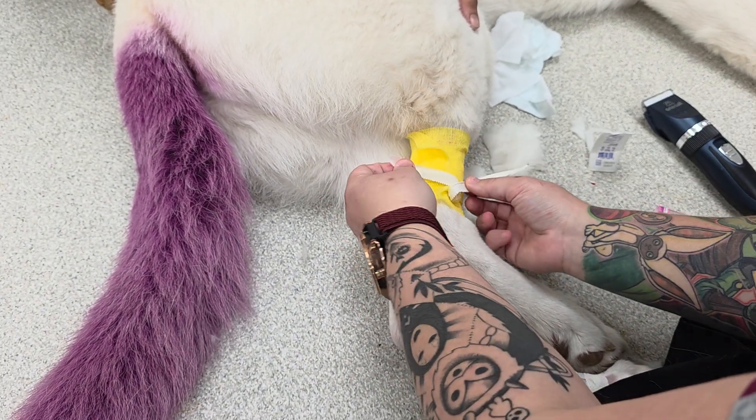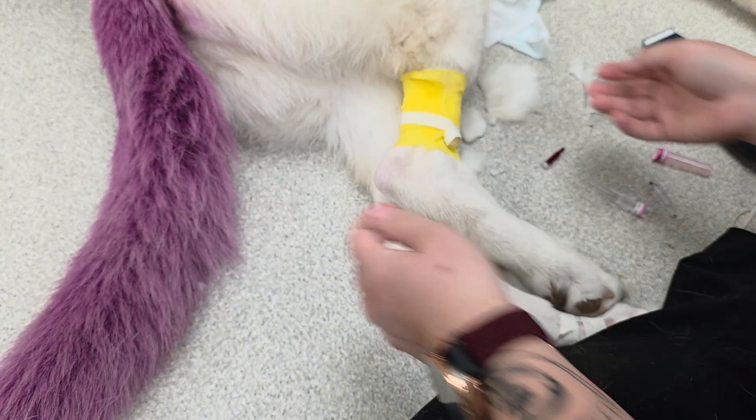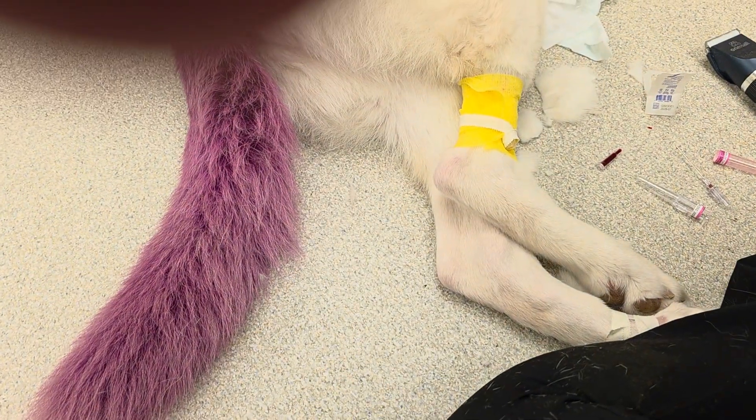And there you go — the back leg catheter is complete.